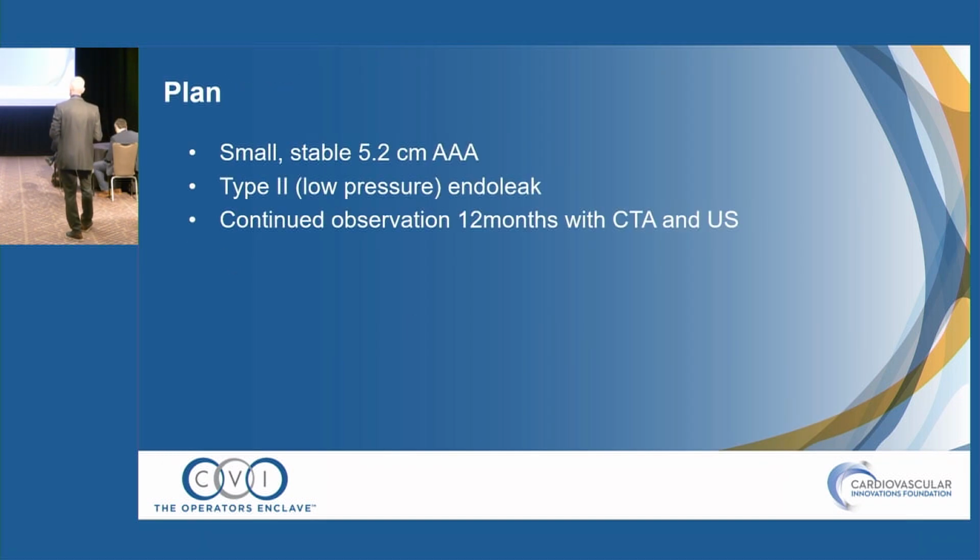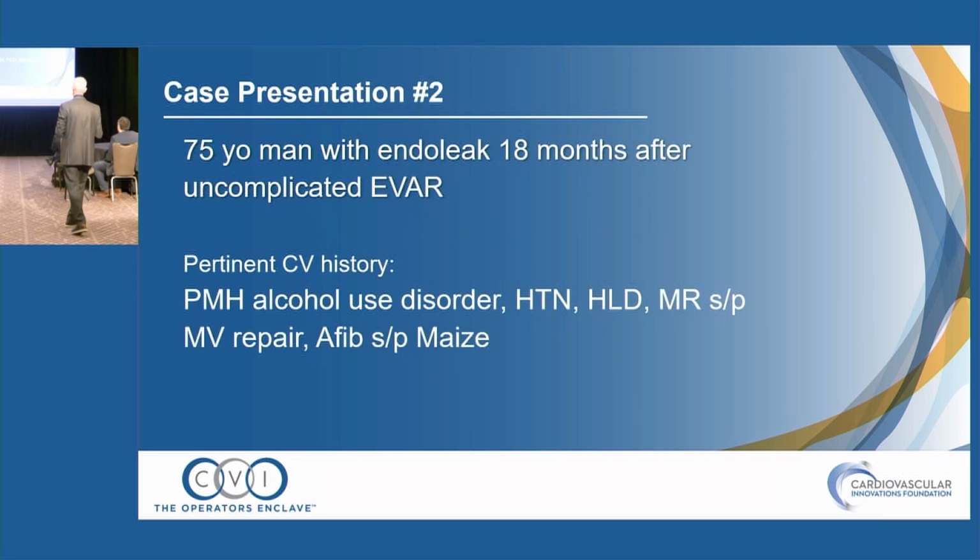I'll skip through these since we got there. So since this is small and stable, it's low pressure, I'd observe him another 12 months and see how he does. So you got a second case, 75-year-old man, he has an endoleak, he's 18 months out.